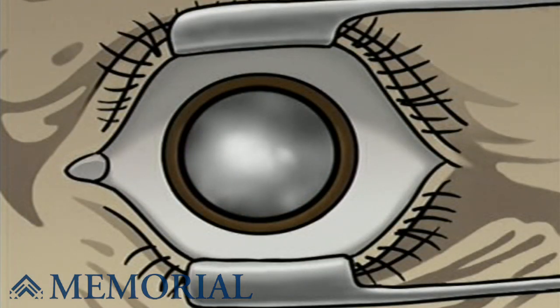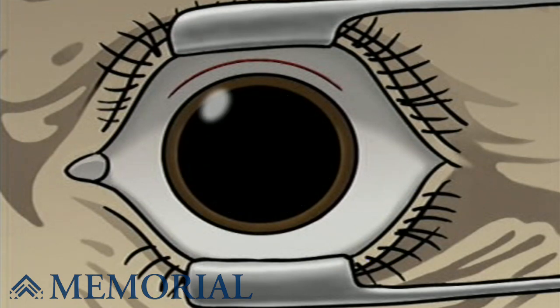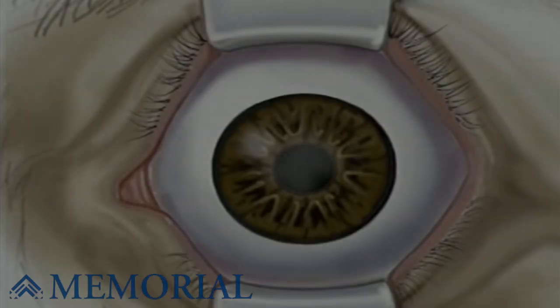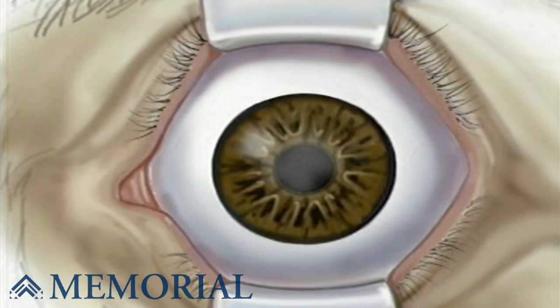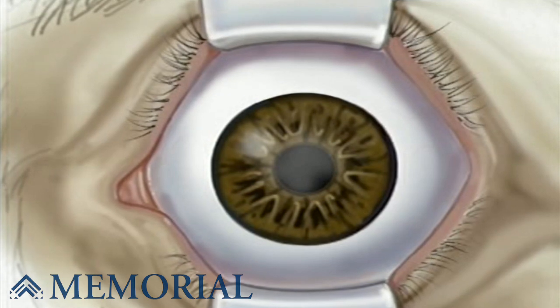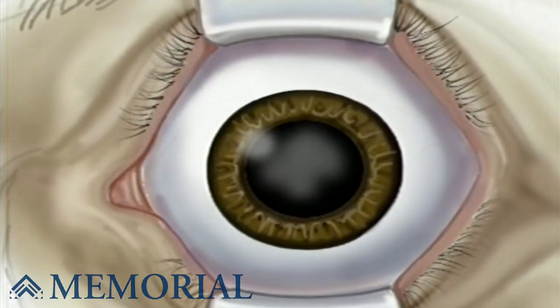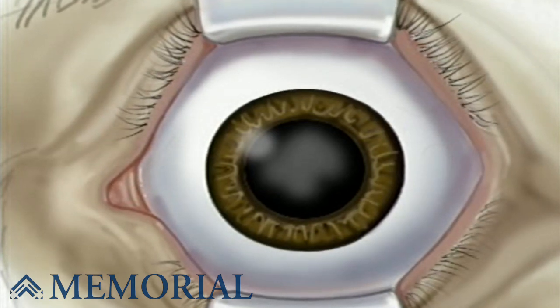Generally, replacing a cataract with an artificial lens is a simple procedure. It usually involves a single incision in the white of the eye. Through this single opening, the cataract is removed and the artificial lens is inserted. The surgeon will position a microscope in front of the eye, and the pupil will be fully open, or dilated.